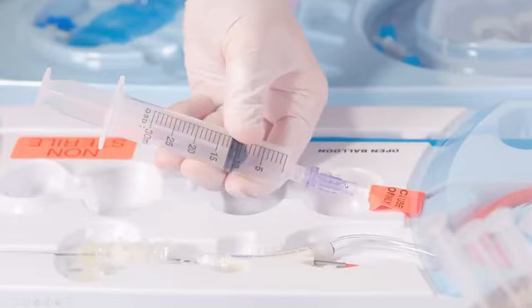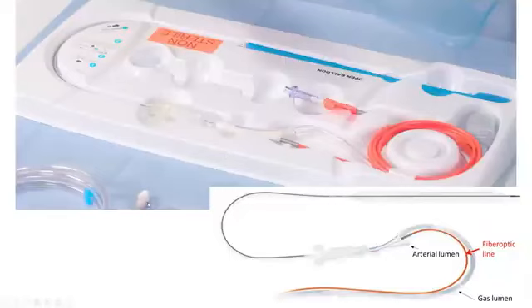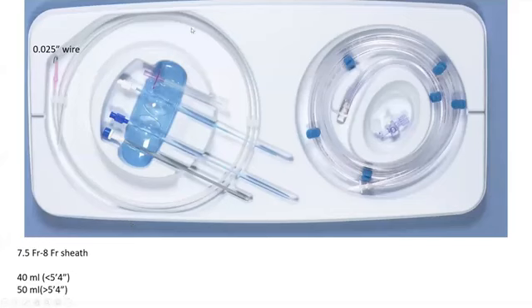Eventually, when you're in the body, you remove that valve and you connect the tubing to the console. Okay, but so you put negative suction on this and you flush the arterial lumen. That's one thing. The second thing is the second tray.